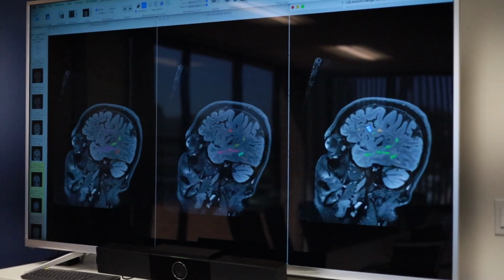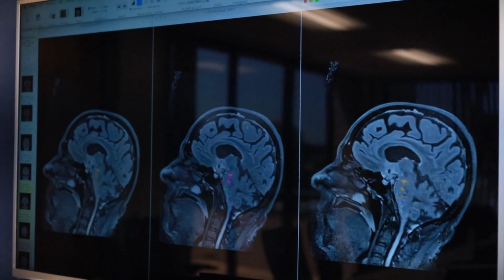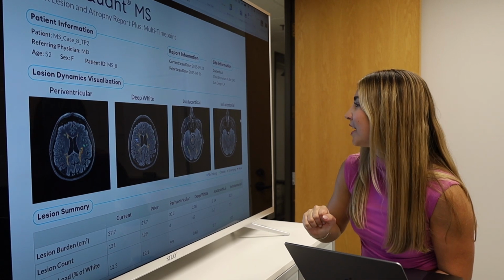It turns out that this is an extremely useful tool, because if a patient only has a few plaques in the brain, it's very easy visually to see what's different from the prior study. But if they have a moderate or severe plaque burden, which most MS patients do over time, it becomes very difficult because of differences in slice sampling and head angulation. Computers are much better than humans at pattern recognition, although humans are better at global reasoning. Because of that, it gives a very accurate picture of where the patient's at, and that information will help inform decisions on changes in disease-modifying therapy.